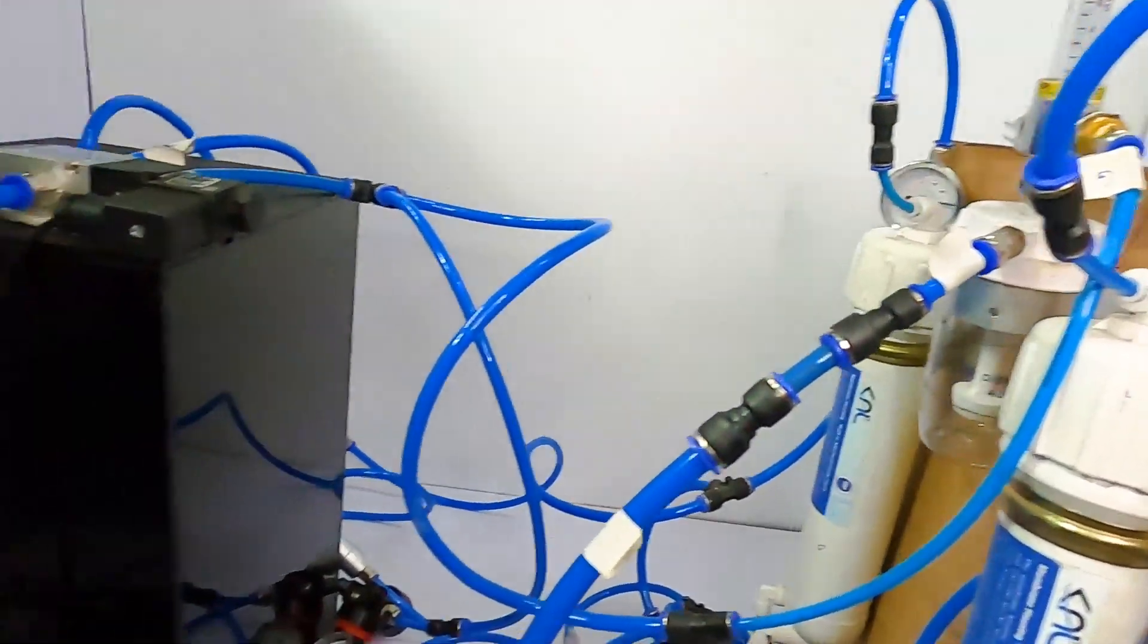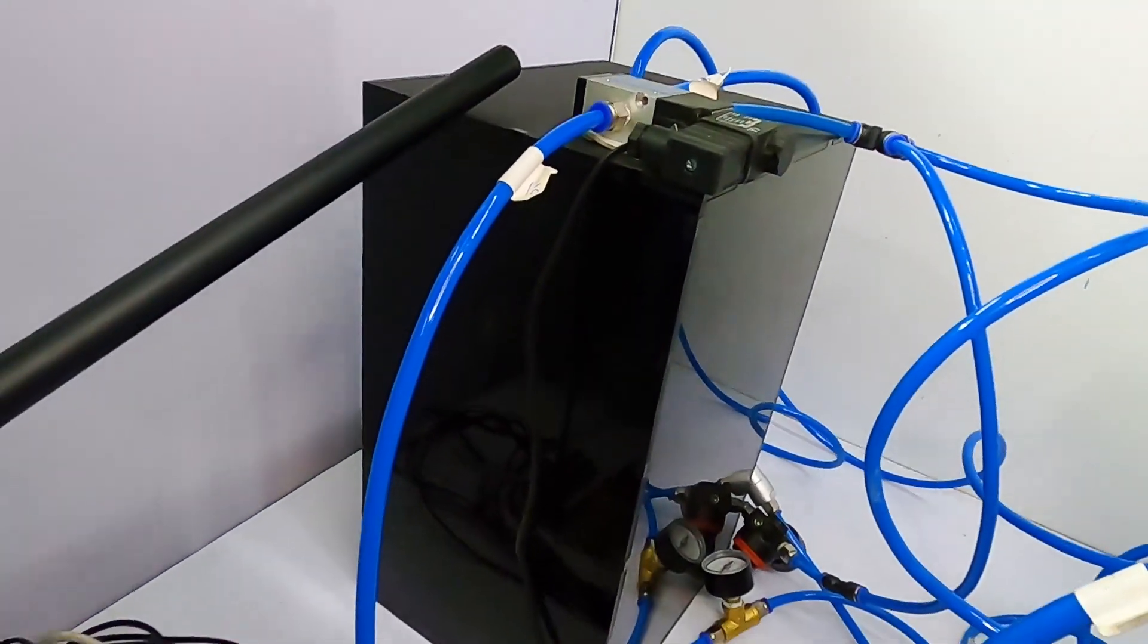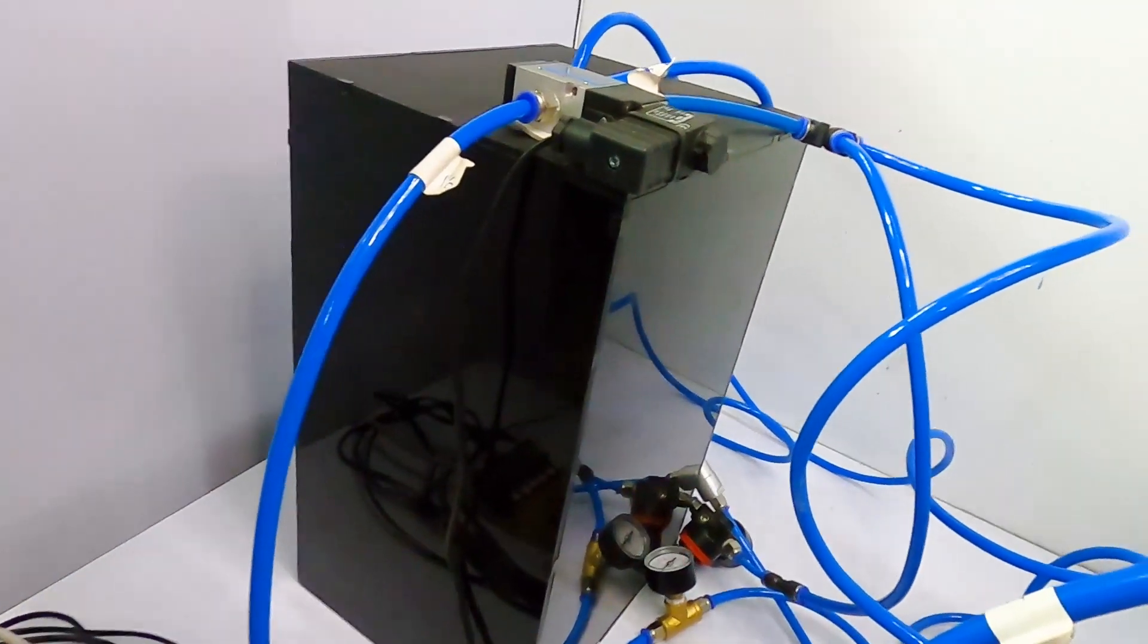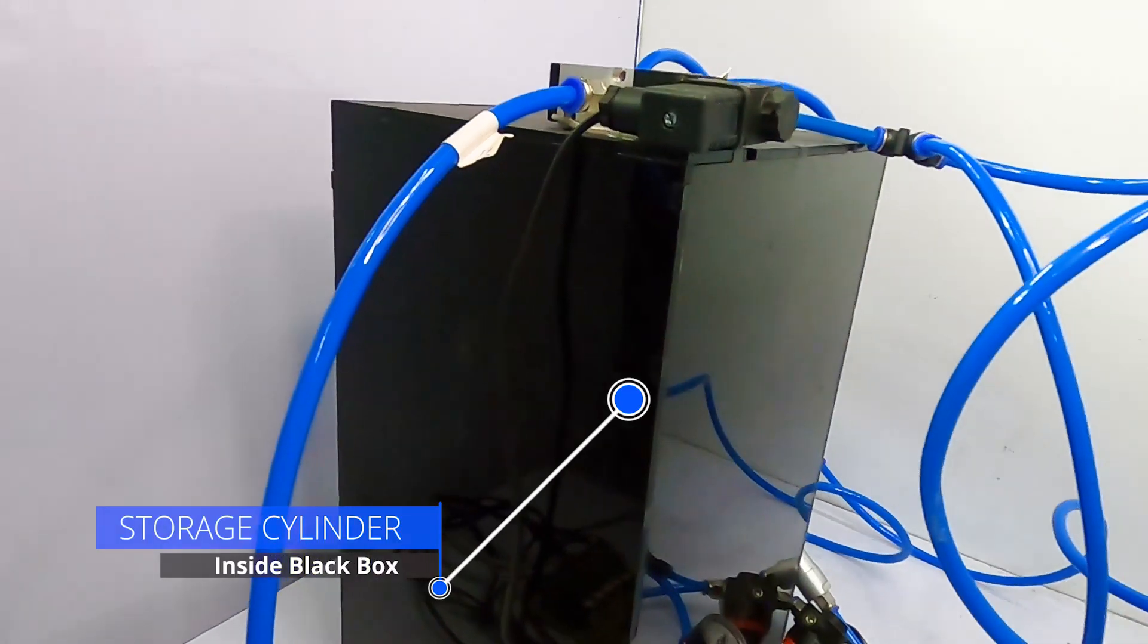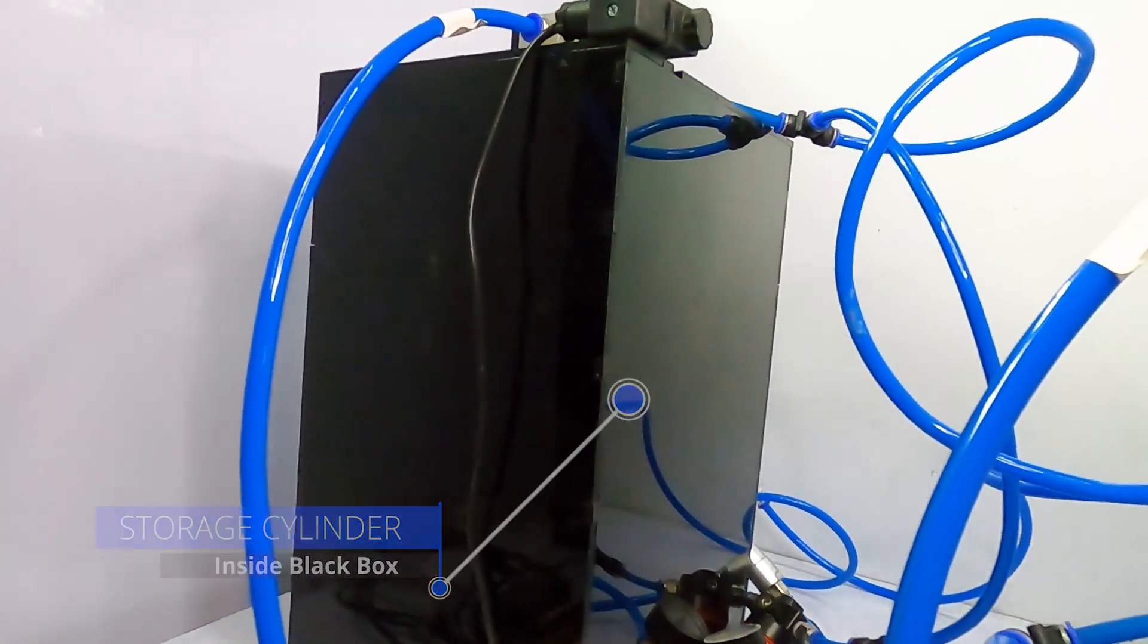Now that we have the oxygen-rich air, high oxygen concentration air generated, we store this air in a separate cylinder which you can see in this black box. This has a separate cylinder which stores the generated oxygen-rich air.